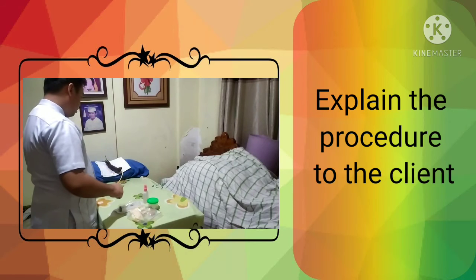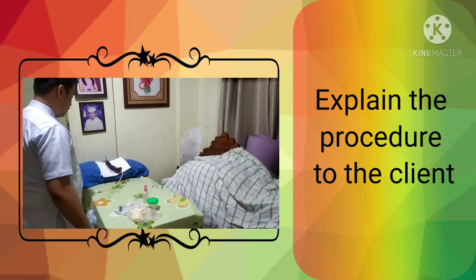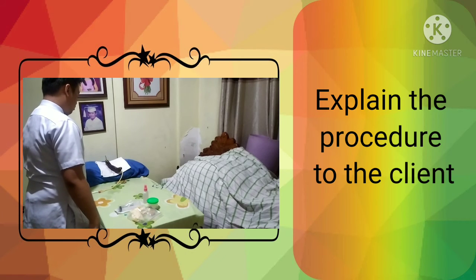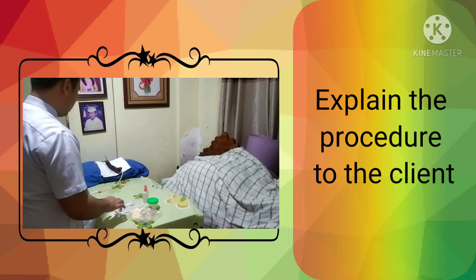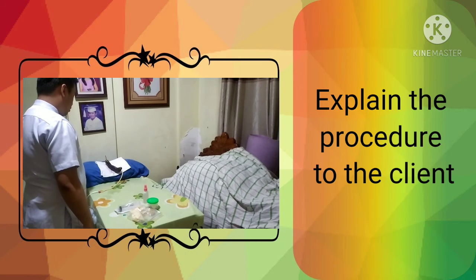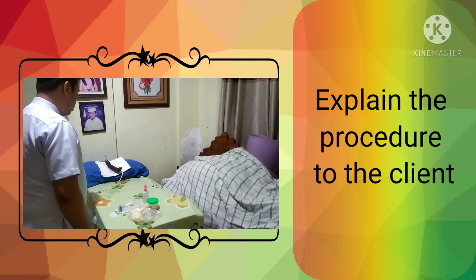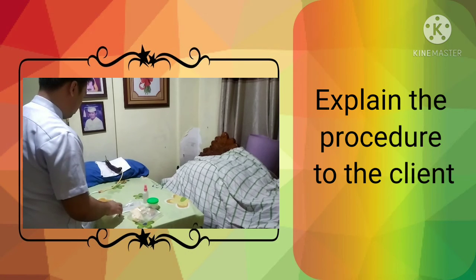Magandang araw po. Ako po si Jed, nurse po ninyo ngayong araw. Ngayon, tatanggalin na po natin yung Foley catheter. So, ano yung pakiramdam po ninyo? Medyo masakit po. Ayun. So, ngayon po, tatanggalin lang po natin. Habang tinatanggal ko po yung Foley catheter, hinga po kayo ng malalim para hindi po ninyo maramdaman yung hindi komportable na pakiramdam habang tinatanggal ko.